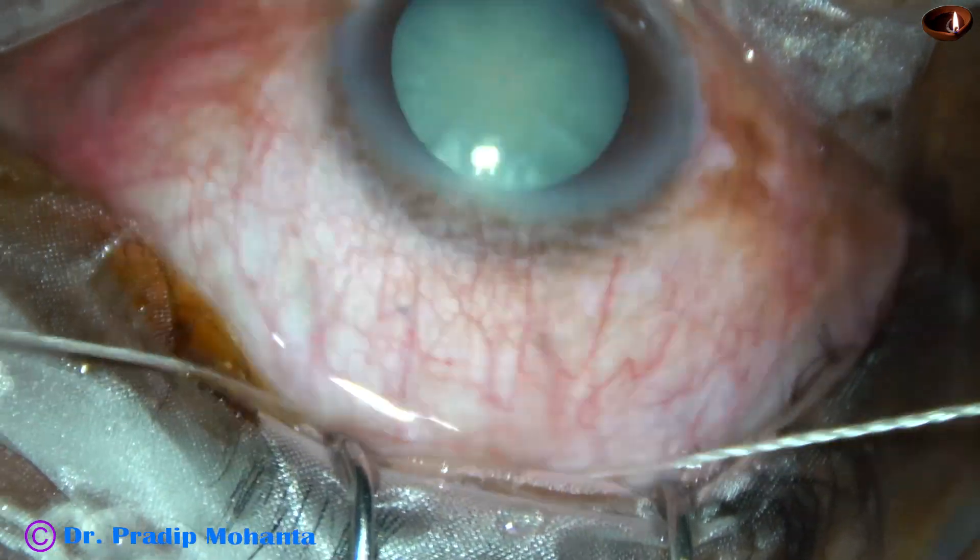This is the side port at around 8 o'clock. As I try to inject an air bubble, the air bubble does not stay. It means there is some positive orbital pressure. Because of peribulbar block, there is some upthrust — vitreous upthrust.